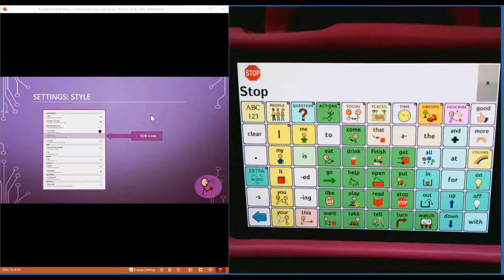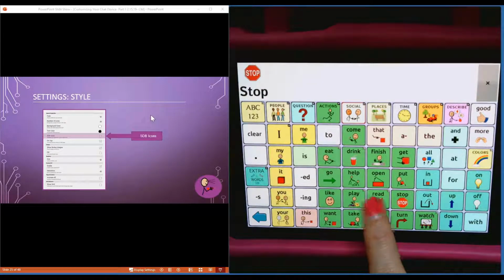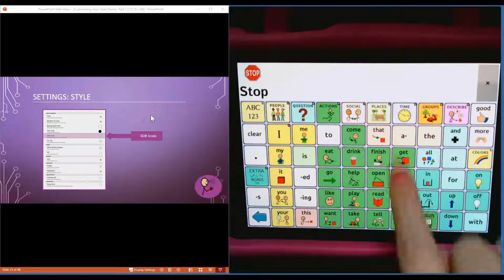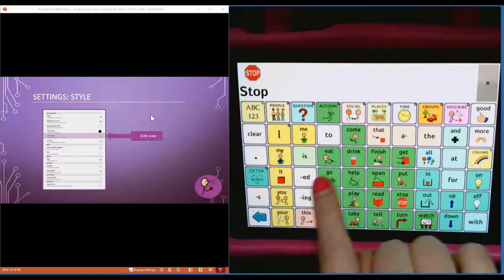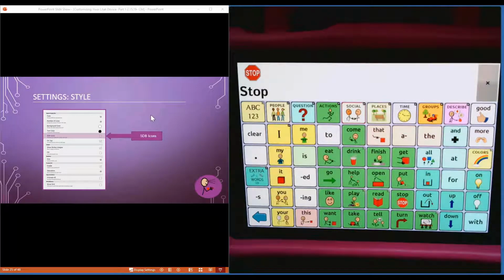And so he communicated to others with his device, and the way people communicated to him, because he was not yet reading, was they also put the instructions on his device. So they said, stop that, or, go outside. And then he could read the icons to understand what people were saying with him. I've had some teams or some people choose to use it to support literacy.